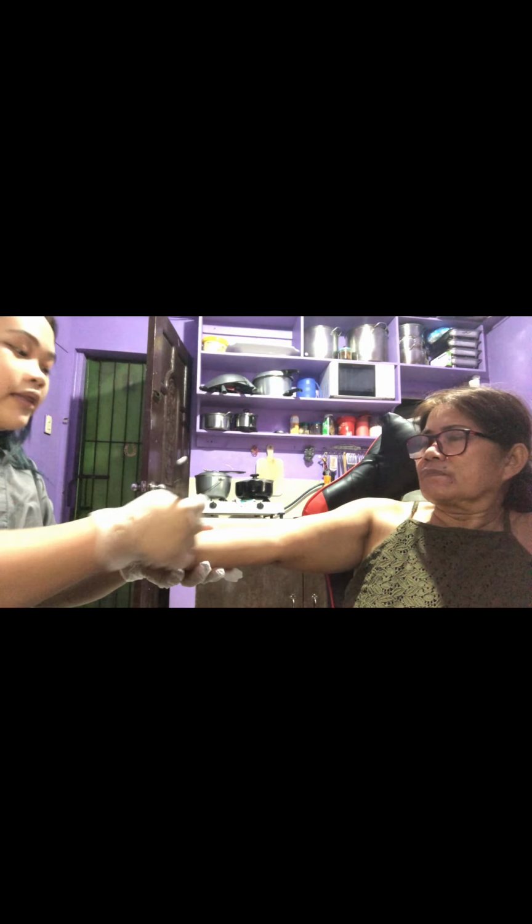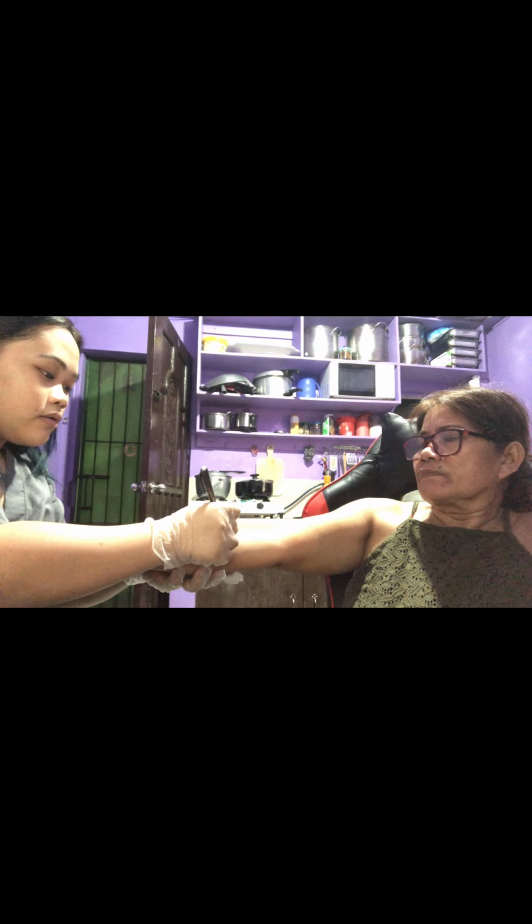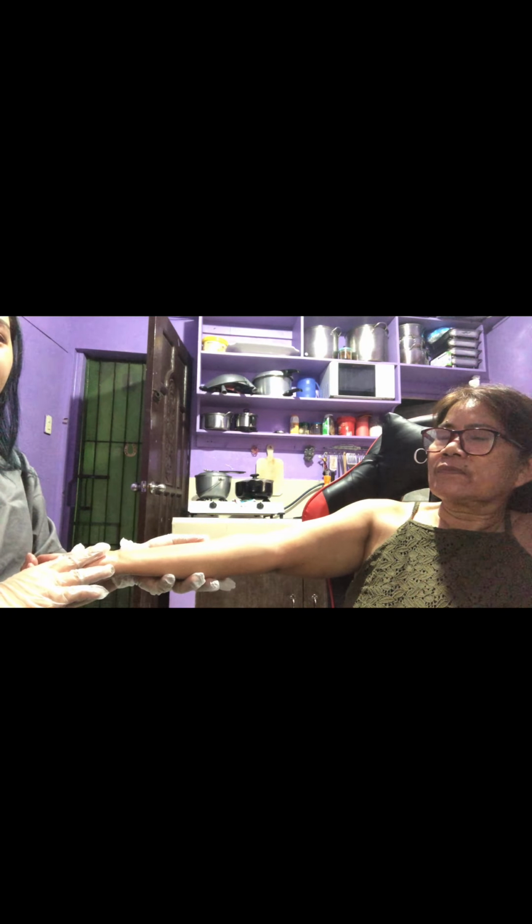Next, encircle the side of the wheal using a blue or black ink pen and then write the abbreviated name of the drug and time of reading. Instruct the patient, do not scratch and press the wheal. Do not recap the needle. Dispose the syringe and needle based on hospital policy.